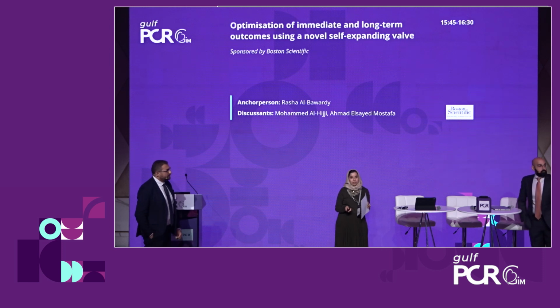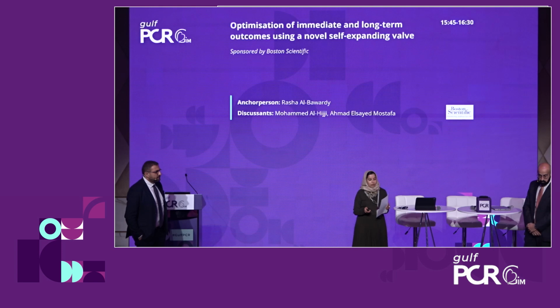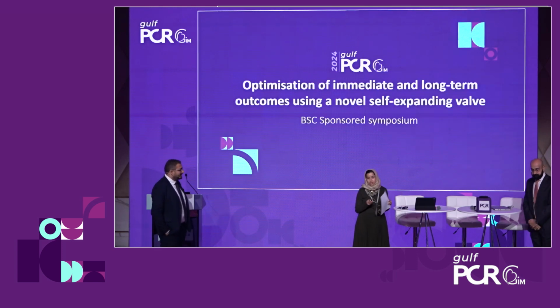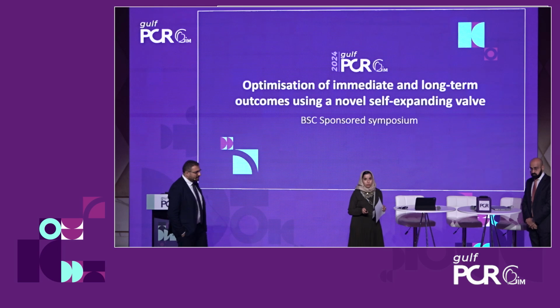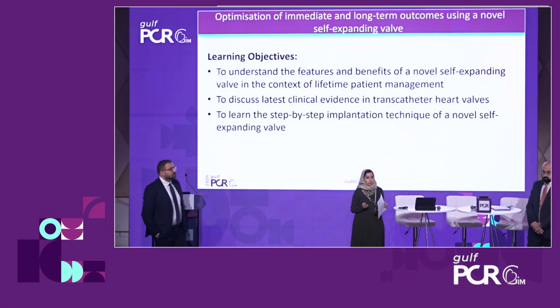We are going to be talking in the next hour about the ACURATE Neo2 valve. I'm joined by Dr. Ahmed Al-Sayed and Dr. Mohammed Al-Hajji. It's really a pleasure to have you both with us. Before we jump into the recorded case that's going to be done by Dr. Ahmed, we're just going to go over the session's objective.